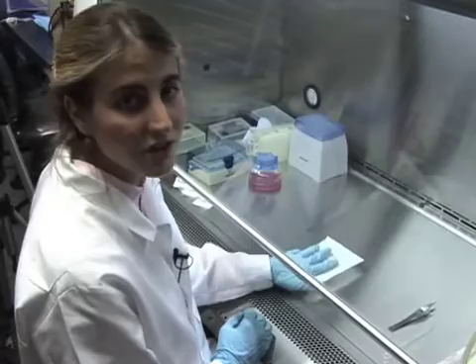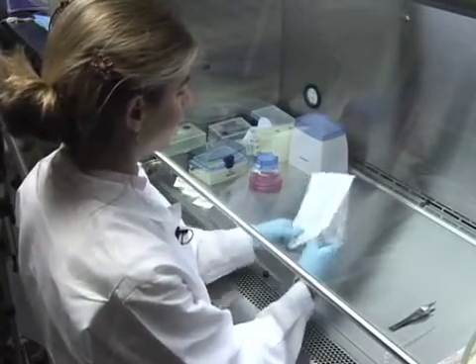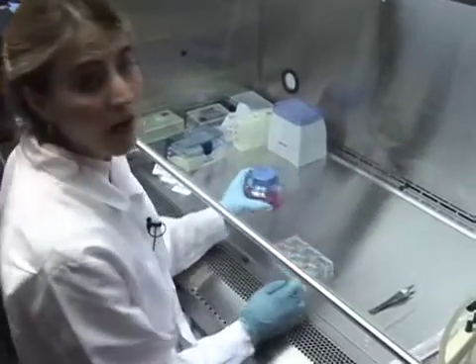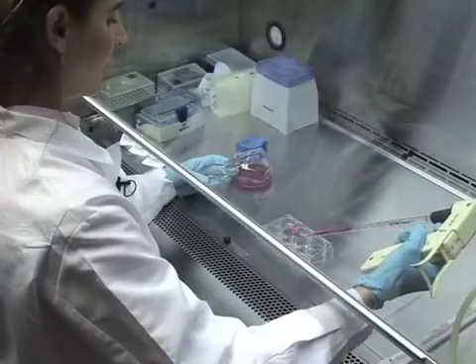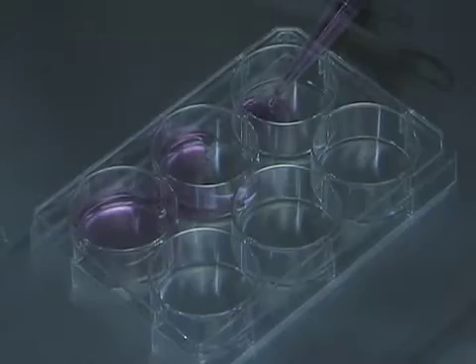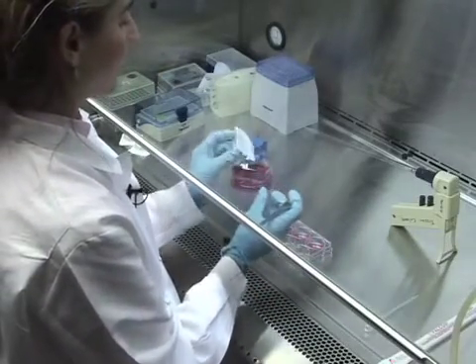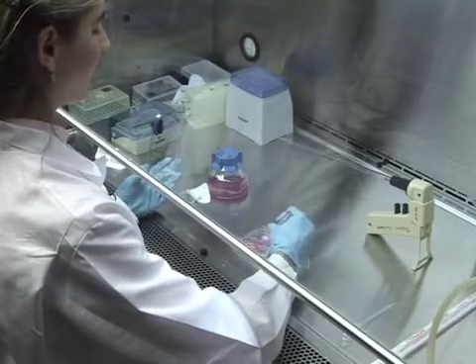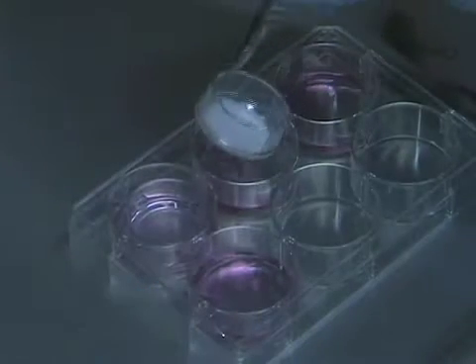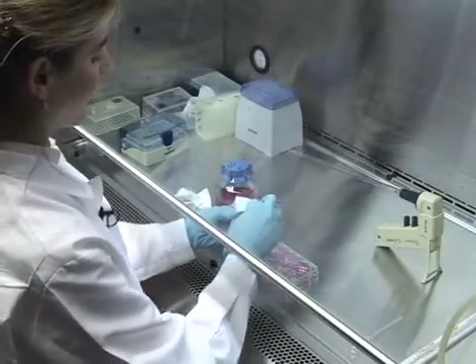Now we're ready to prepare the dishes in the culture system to incubate the slices. We take a six-well plate and in each well we put about a milliliter and a half of slice culture media that we pre-prepared and warmed up to 37 degrees. Then we take our Millicel filters and place them on top of the media — you want to get rid of any bubbles, as you don't want bubbles under the filter. These filters allow the slices to soak up nutrients from the media while remaining exposed to the air so that they don't suffocate.